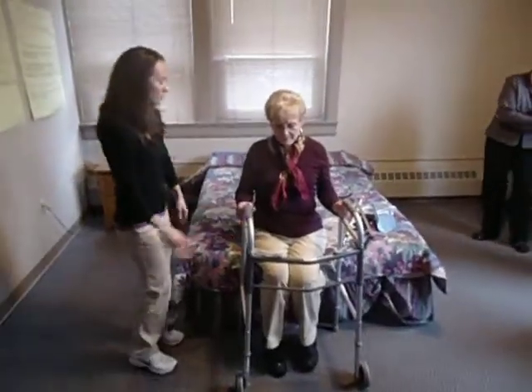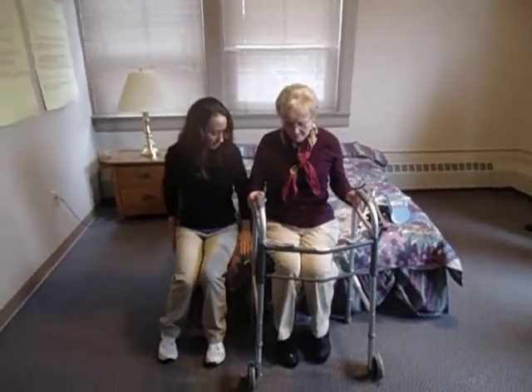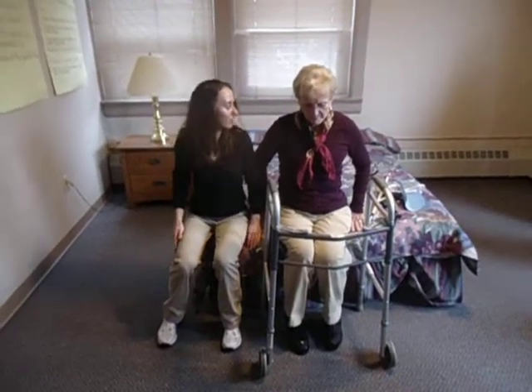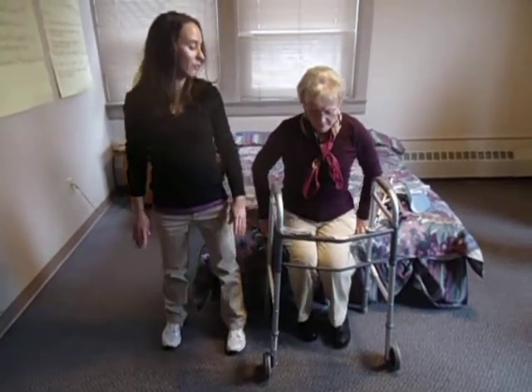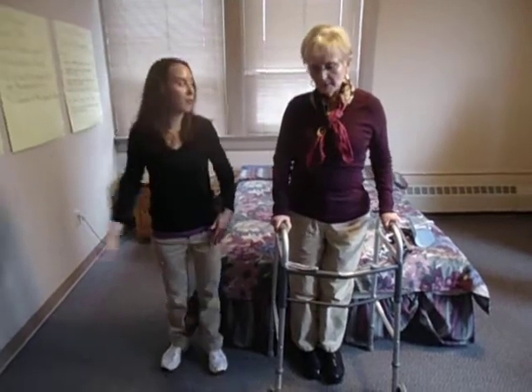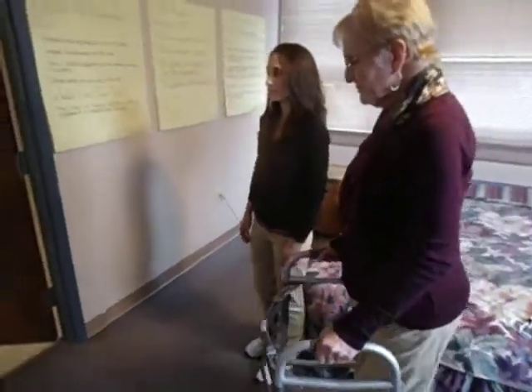Okay, Mrs. Jones, in order to properly stand up, what I want you to first do is use the bed and your hands to help yourself get up without bending forward, okay? You gotta remember your hip precautions. So if you can, use your hands to help yourself stand straight up from the bed. Good. Now you can grab a hold of the walker and we're gonna walk over to the bathroom. Okay. And we are going to try a toilet transfer with a raised toilet seat.